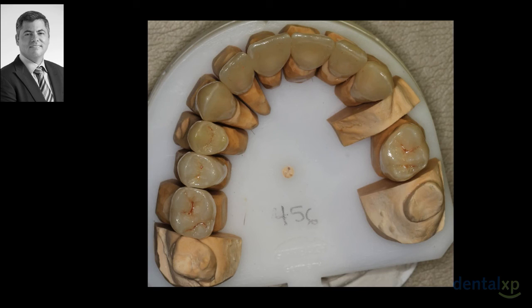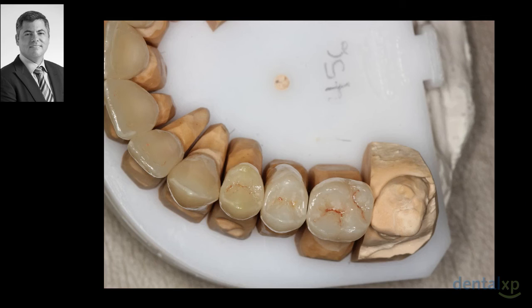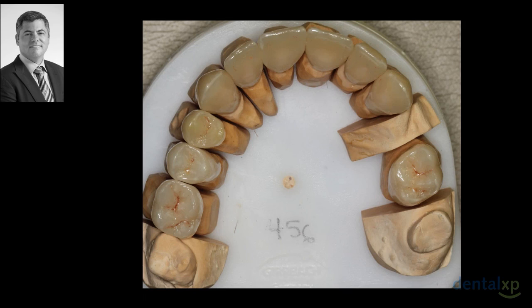And this is the work that we get from the lab. I like my technician to do some characterization and some staining in my ceramics. The technician was Rafael Santrich, who is a certified dental technician in Aventura, Florida, one of the towns in Miami. He's a great technician, great ceramist.